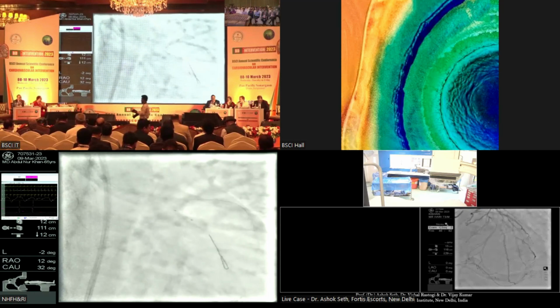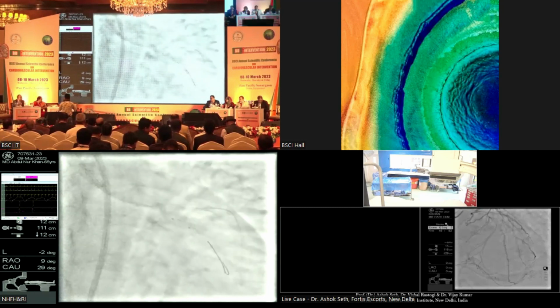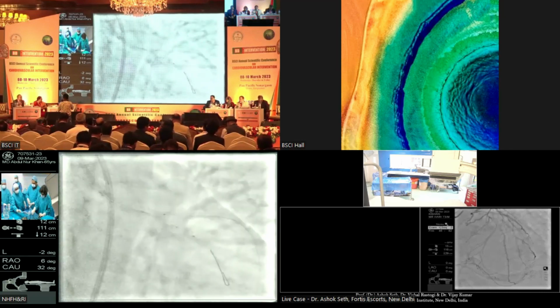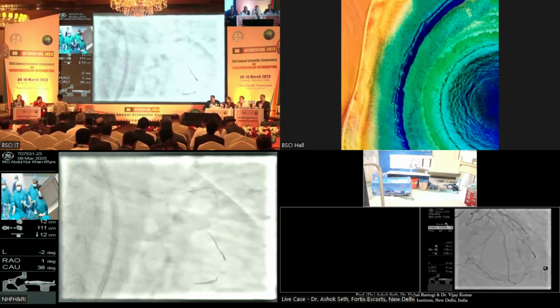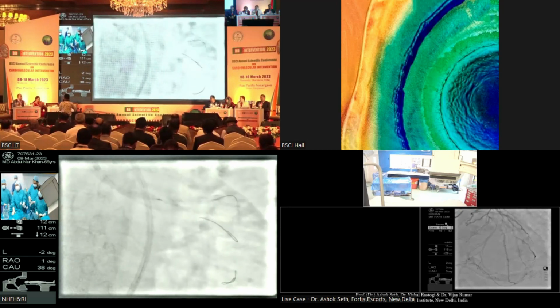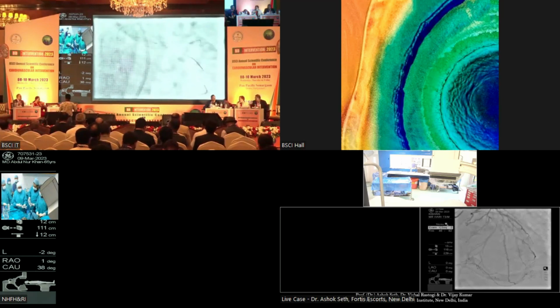Dr. Asha, I want to know from you, what is your usual strategy when the side branch should be approached with DCB and requiring kissing balloon inflation with the main branch? Do you usually do kissing with that drug balloon, or after implanting the drug balloon, do you take another balloon and do the kiss? Actually, what we do is with the same DCB balloon, we do that, that's it. As you know, after the placement of the DCB, nothing else should go, so as not to impair the vessel. Nothing else should go.